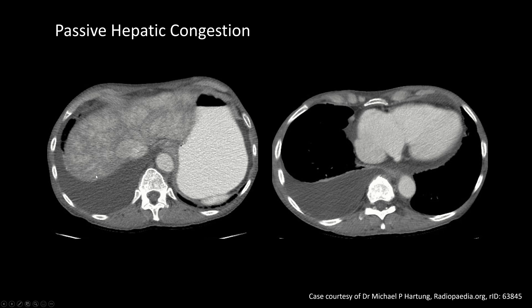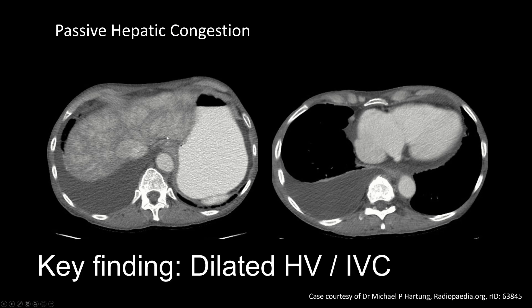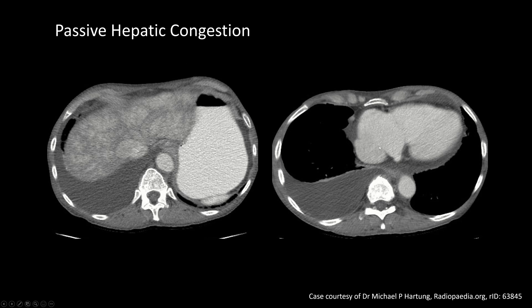Along with these parenchymal changes, you're also going to see in these patients dilated IVC and hepatic veins, as you see here in this case. This is the key finding that, in addition to the parenchymal findings, indicates passive hepatic congestion. You'll often also see a dilated right atrium or some other cardiac process. Down the line, this can lead to findings of portal hypertension and cirrhosis.